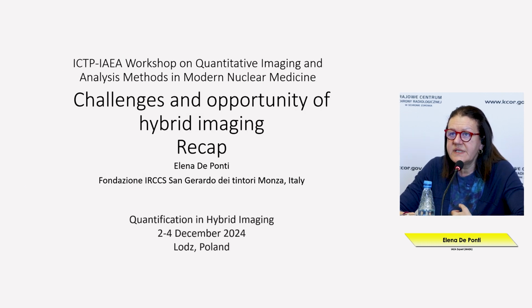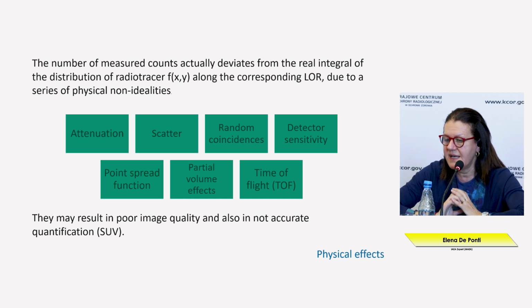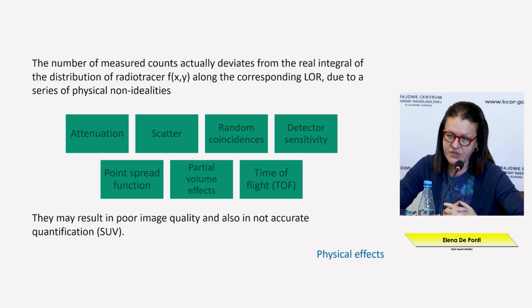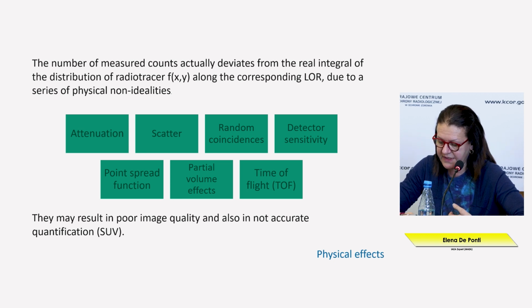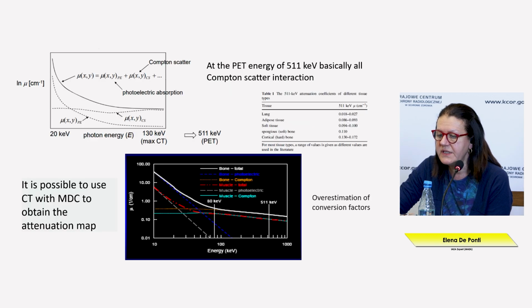Let's move to the second recap. We have discussed in this second presentation all the corrections and calibrations that we can include in our routine and that are available on the scanners, to identify their crucial points and to identify what they do on the data.